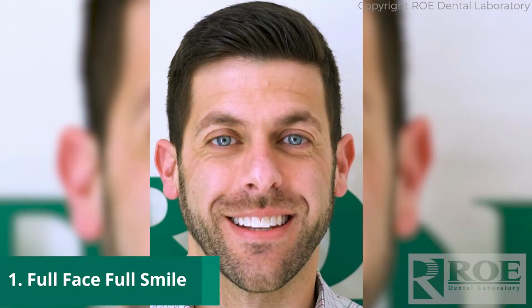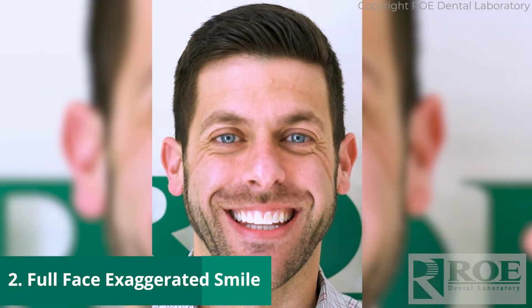And then you ask the patient to smile. And often with these patients who've been suffering, they're not going to give you an exaggerated smile. That's okay. That's our first picture. The second photograph will be an exaggerated smile. And patients usually in this condition that we're doing these cases in, they've not had an exaggerated smile in a long time, so it could be a little tricky. So say something funny, something lighthearted, and try to get the patient to do a full smile, and then try to get them to maintain the same position. So full smile, we want to see the transition line in the future prosthetic, right? So we want to make sure we see where that upper lip is extended the most, so a full smile.